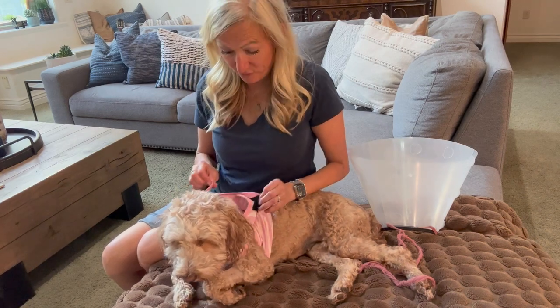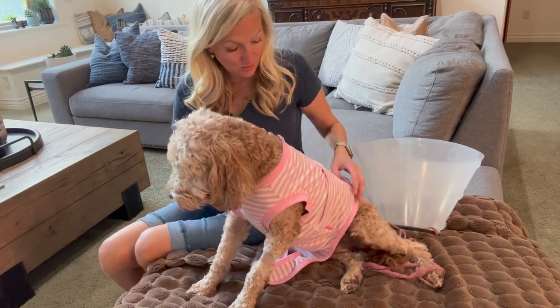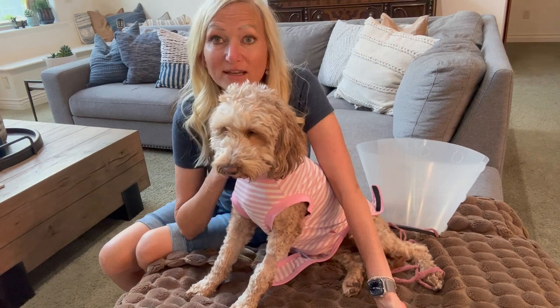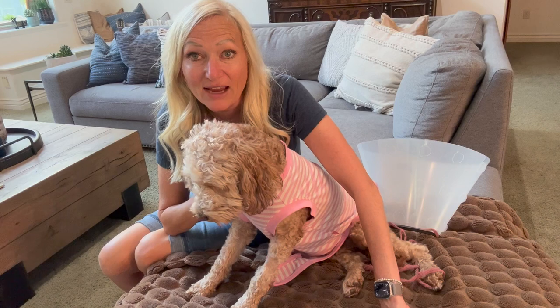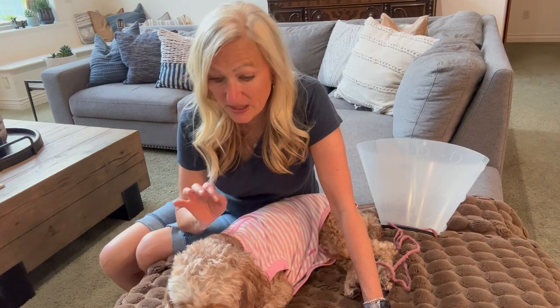These surgery recovery suits are not just for when your animal gets spayed — they also come in a male version for dogs that get neutered. Coco had a batch of puppies a few months ago and they did not want to be weaned; they just wanted to keep nursing. This suit covers up all the nipples, so it can also be used to wean puppies. And another use mentioned on Amazon is you can put this on when they're in heat. It's got multiple uses, but for sure this has been so great for covering Coco's incision.